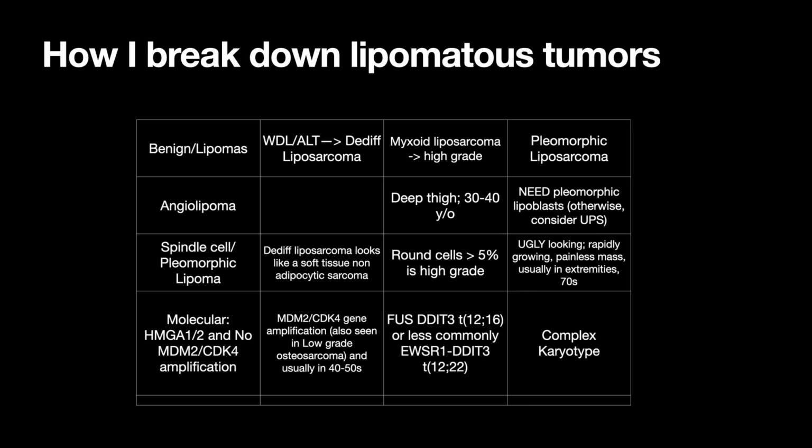Lastly, your pleomorphic liposarcoma, you need pleomorphic lipoblasts histologically. Otherwise, you want to consider undifferentiated pleomorphic sarcoma. Whether it's pleomorphic liposarcoma or undifferentiated pleomorphic sarcoma, they are ugly looking.